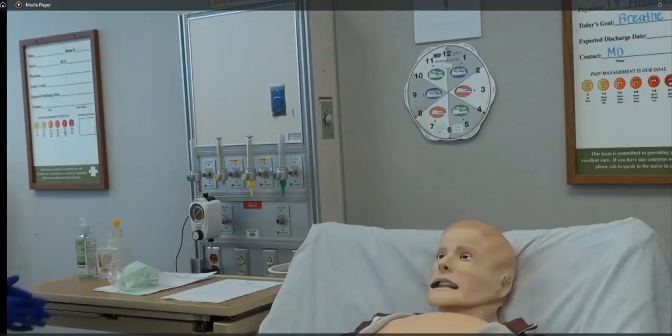Now that you've seen the demonstration of the administration of oxygen via nasal cannula without humidification, now we will demonstrate the administration of oxygen via nasal cannula using humidification. If you look in this picture, you can see a humidification bottle sitting over here to the left. So to begin, we will repeat steps 1 through 5. And then, instead of directly connecting the tubing to the oxygen wall source, we're going to add this humidity bottle. Let's begin.